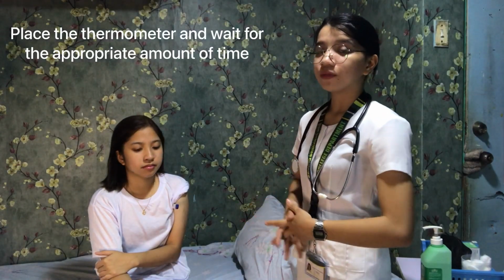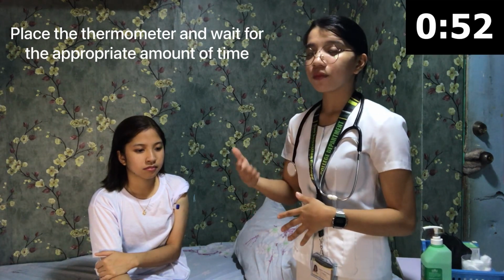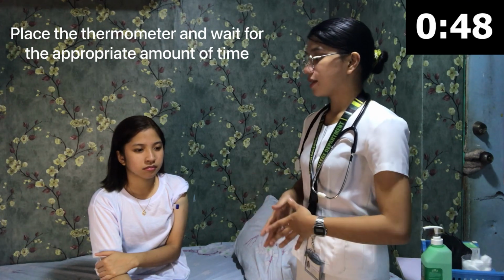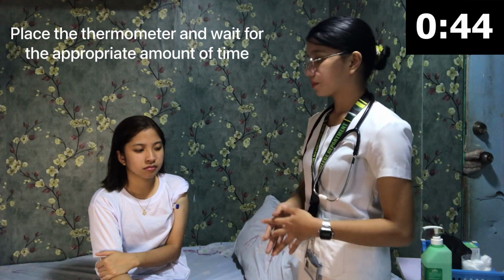We're going to have to wait for a few minutes, and when the thermometer beeps, that indicates it has already obtained the body temperature.